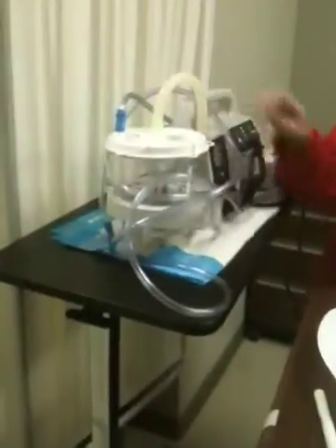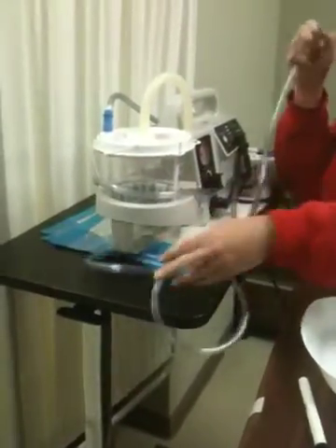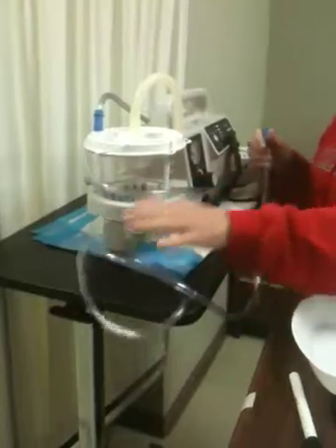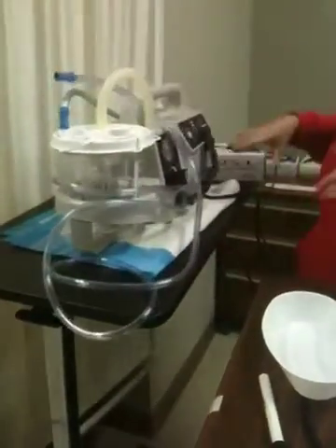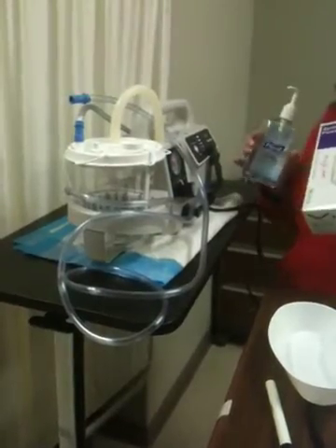We also have our suction equipment, and you always want to make sure that your suction equipment is working. For the sake of sound I'm going to keep it turned off. And of course my gloves and hand hygiene — my sanitizer.